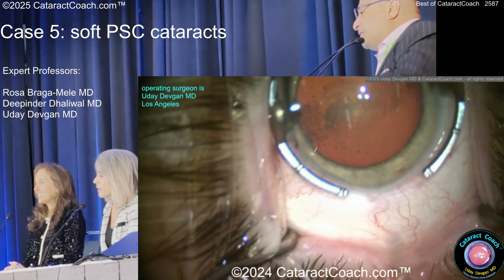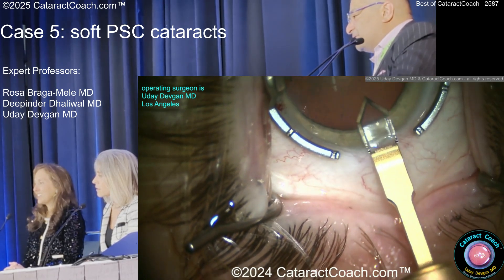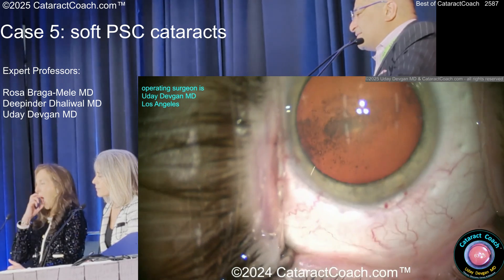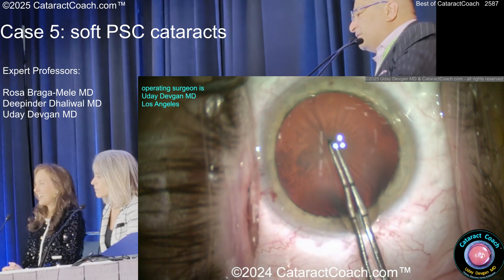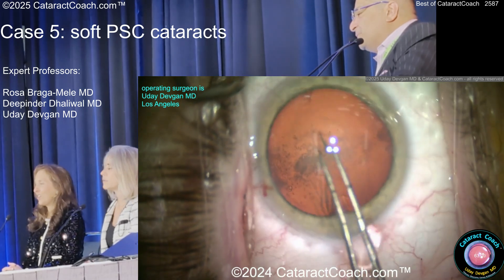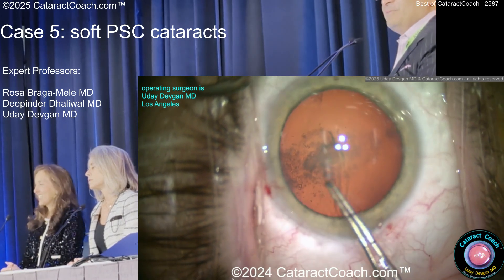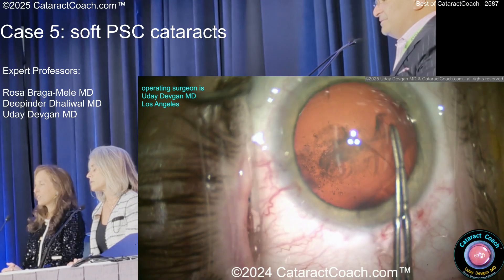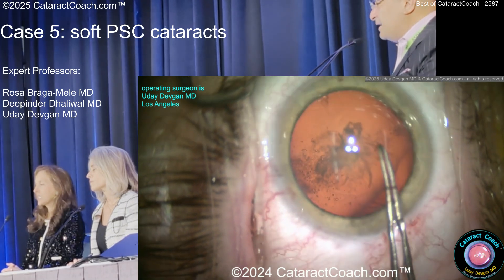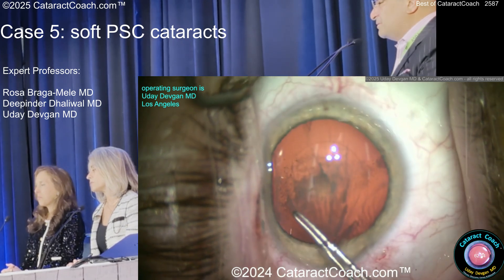You're not going to do divide and conquer on this thing. This is me operating — you can always tell I like diamonds because I'm in Beverly Hills. We'll get a nice good rhexis here. I'm flipping this out of the bag. That thing looks like butter to me. Stria. What does that mean for people who don't know? That's zonular issues — zonular weakness. That's kind of common in these ultra-myopes. Blue-eyed too.